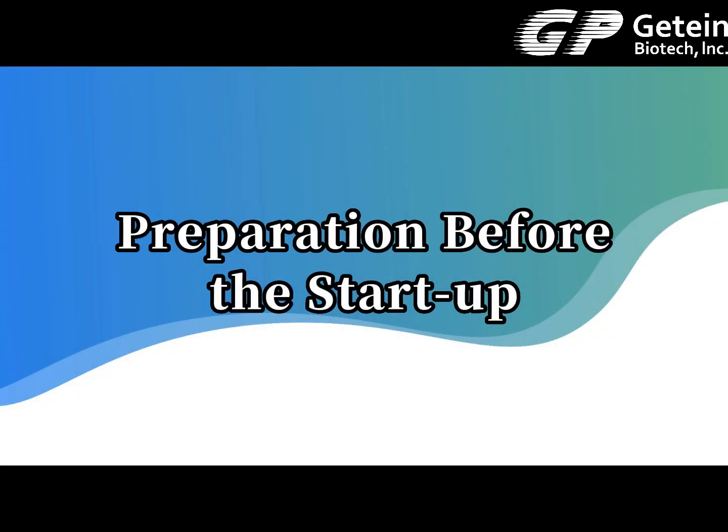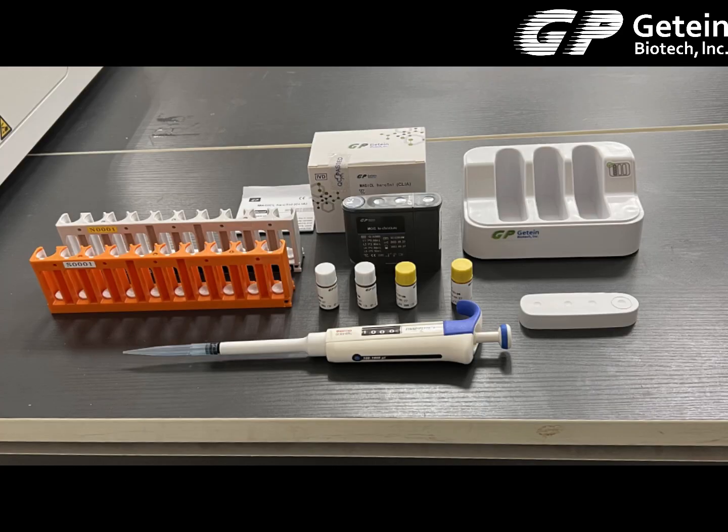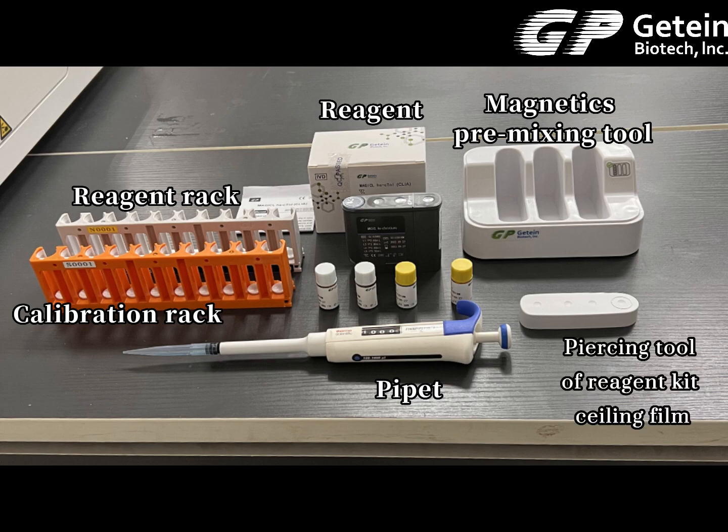Preparation before startup: preparing the experimental materials, including the magnetics pre-mixing tool, reagent, calibration rack, reagent rack, pipette, and piercing tool of reagent kit sealing film.